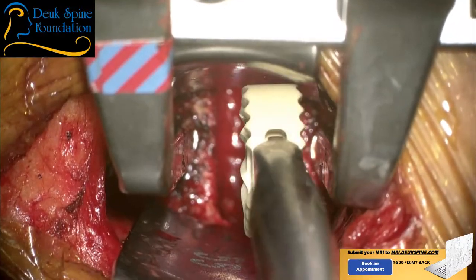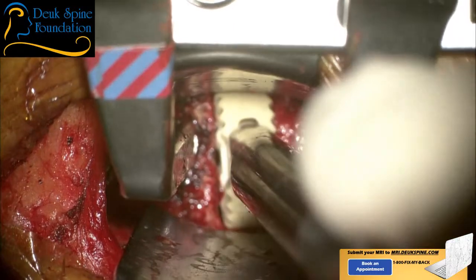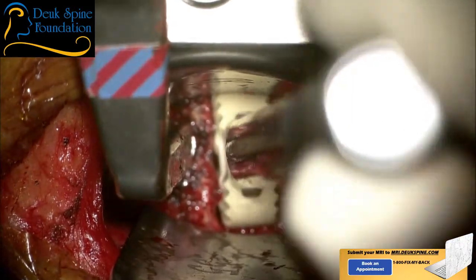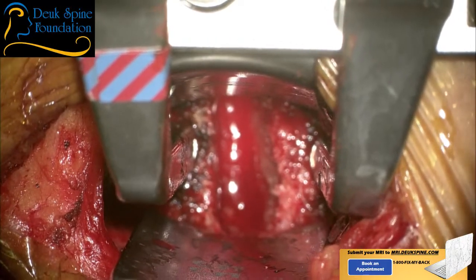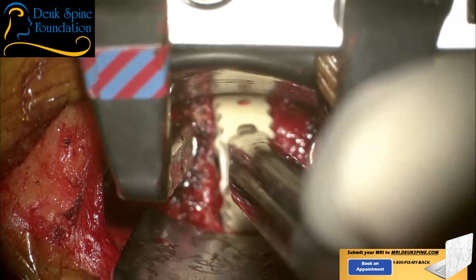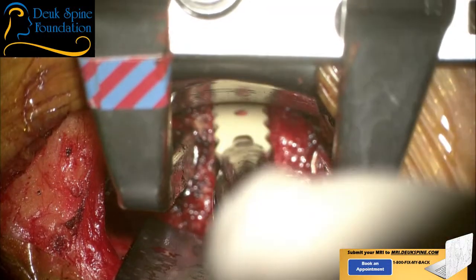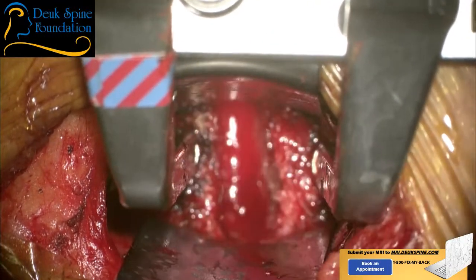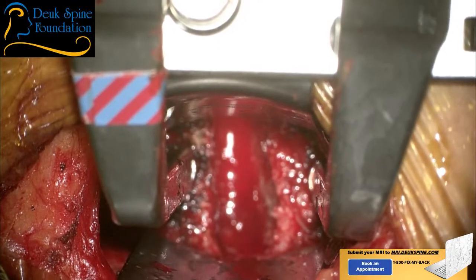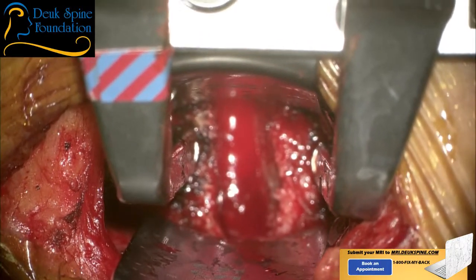This may be too big. Let me see. Actually, that's pretty nice. I don't know, I'm contemplating. Seven is the right size. But I just say we go with the small. It's pushing it a little bit. And what I don't want to do is push something into the foramen laterally. All right, drill.